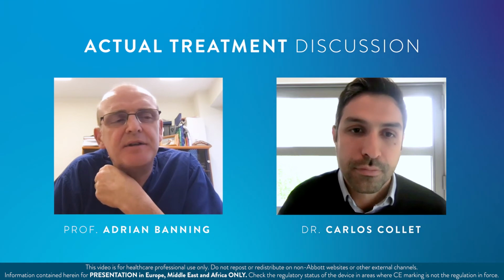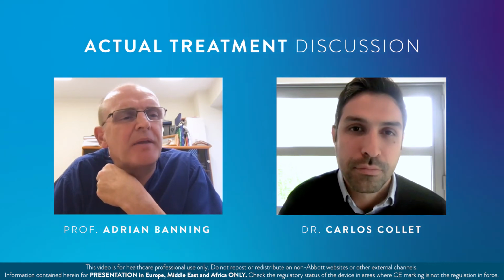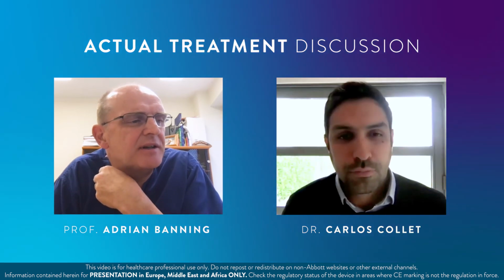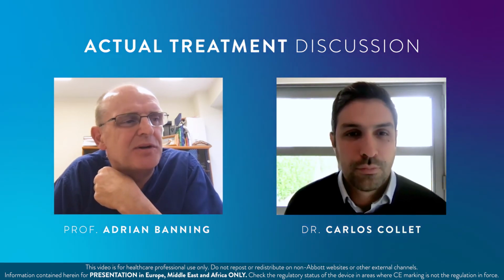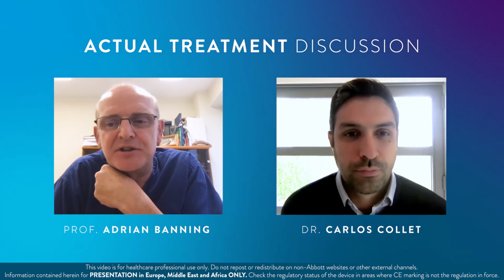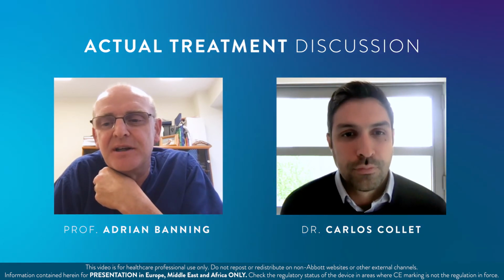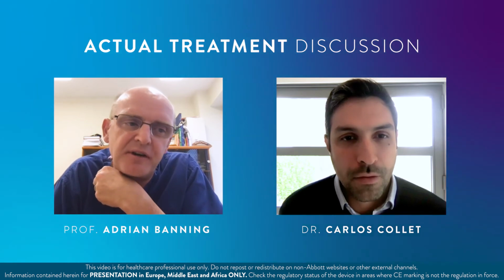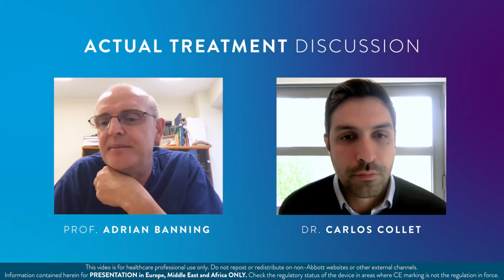I think one of the relevant comments I would make about that is, going back to the natural history of this, it's quite possible that there's been an element of restenosis here for some years. This is not a procedure that was done 9 months ago. This was a procedure that was done many years ago. And it may be that this patient's been pretty well with an angiographic result which was not perfect for a long time.